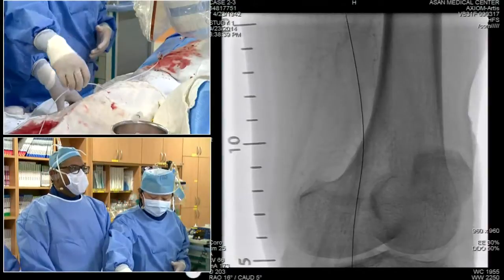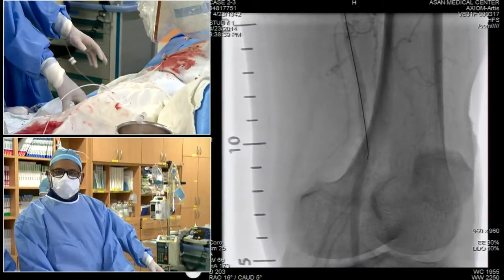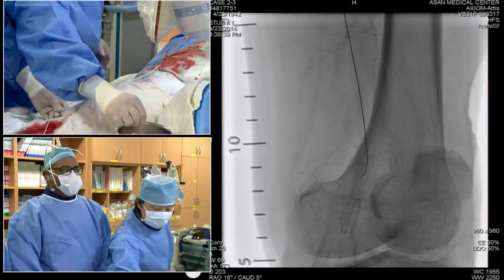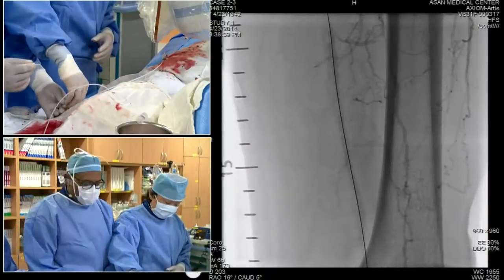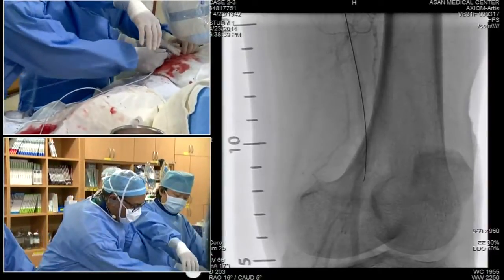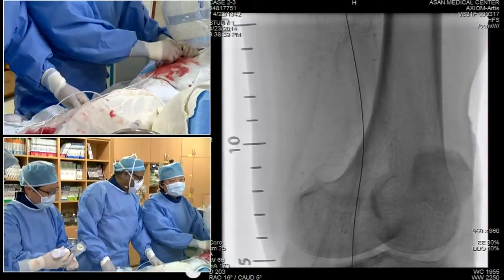You know, John, we know the data from Dr. Nobuyoshi with regards to the grading of in-stent restenosis, and this would be a class 3 ISR. So if we just balloon this, we can expect restenosis within the stented segment, we can pretty much count on it, actually. The balloon is not available, the RX. You have no RX? Yeah, so we just have to go with this.